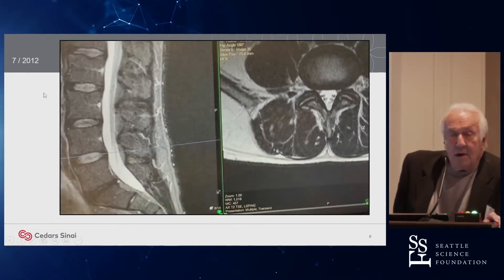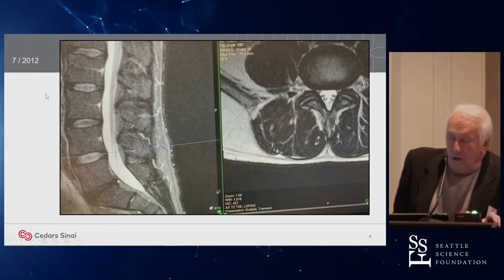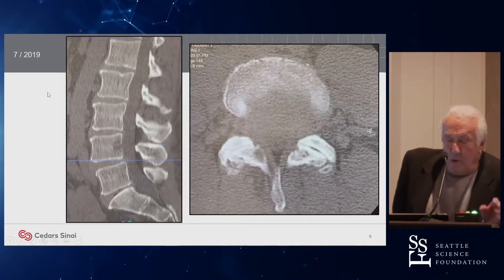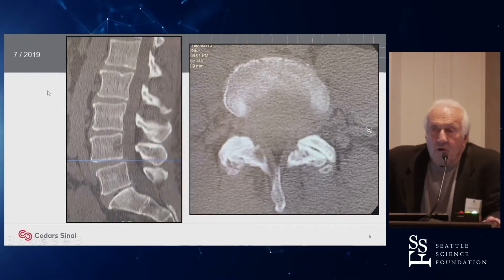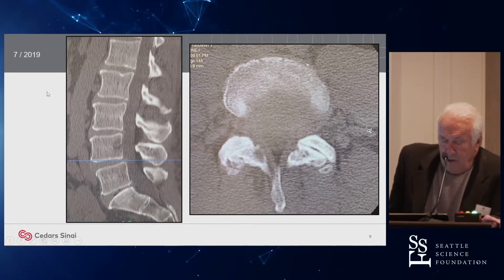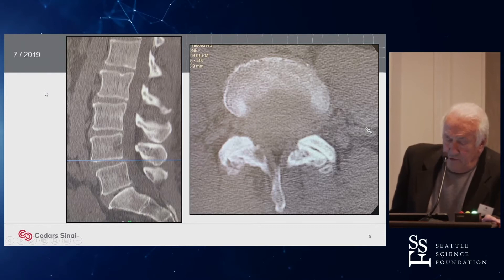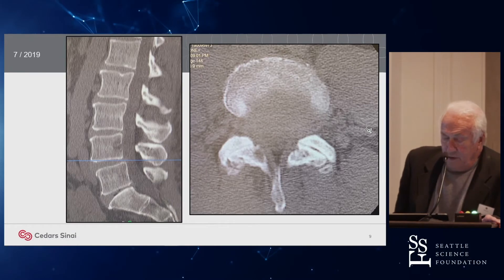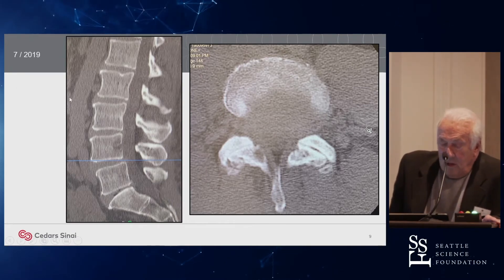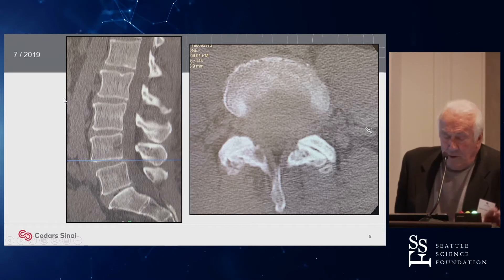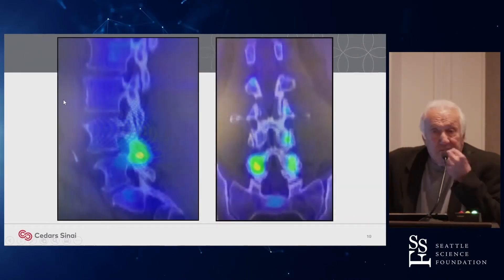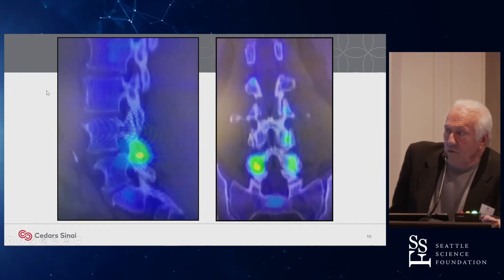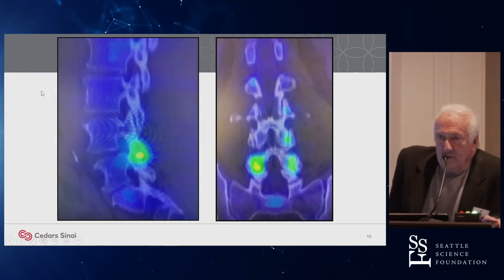An MRI done in July 2012 showed a degenerative L5-1 disc with the rest of his spine rather pristine. Seven years later, he's got a little bit of a bulge, a degenerative spondylolisthesis at L4-5, and a little bit of stenosis visible on the CT scan. We got a SPECT scan, and it shows uptake in the facet joints at L4-5, which is not surprising given the degenerative spondy.